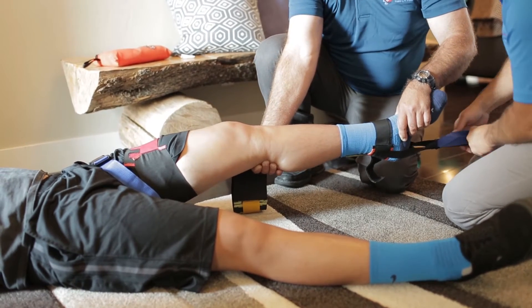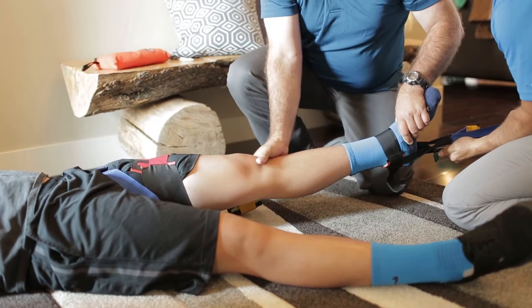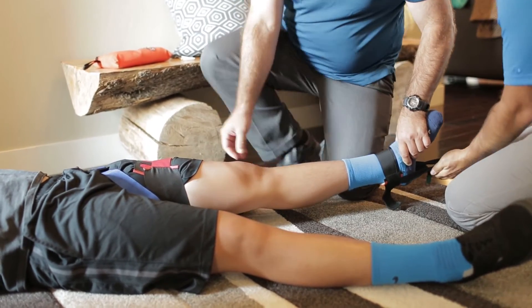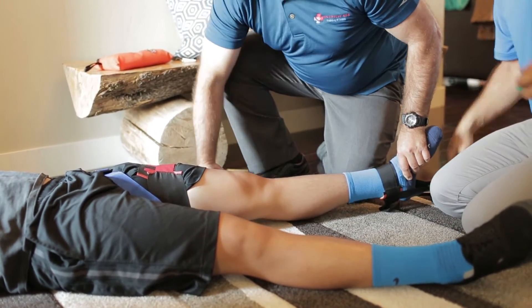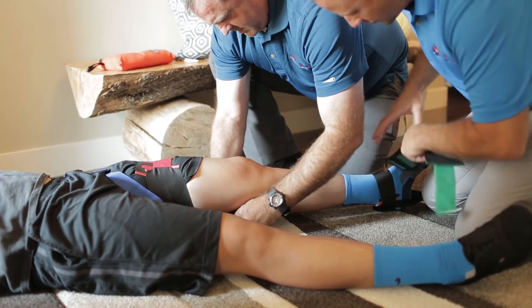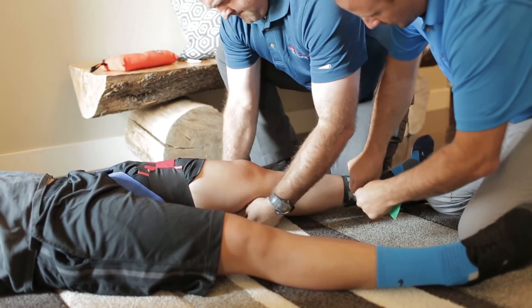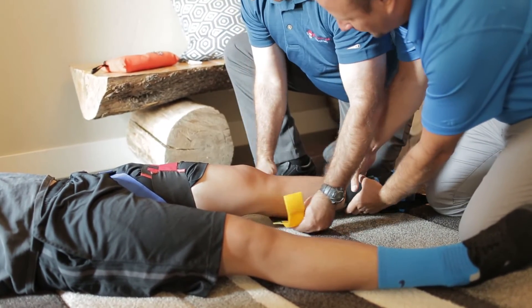What I'm doing now is taking the place of that manual traction that Rescuer 2 was giving. These straps are color-coded just like a stop sign or a stoplight. I go red first, then yellow — placed somewhere below the fracture. Red right above, yellow right below, and then green around the ankle.